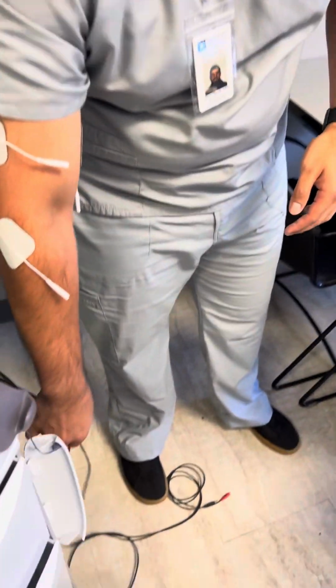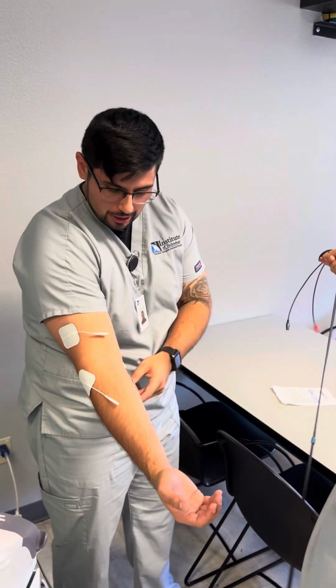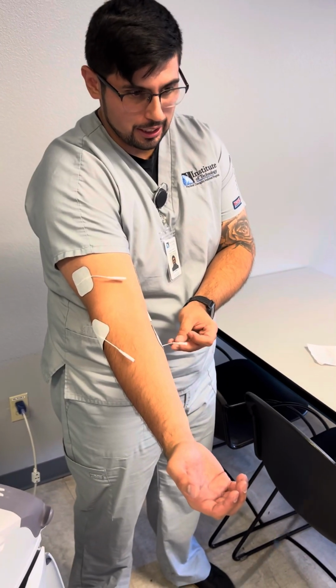Before you leave, one more thing. All right, so we're gonna grab this, and we're gonna make sure it crisscrosses. We're gonna place one here on the top.